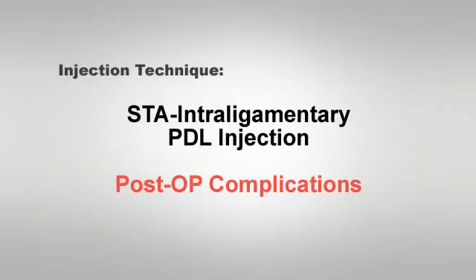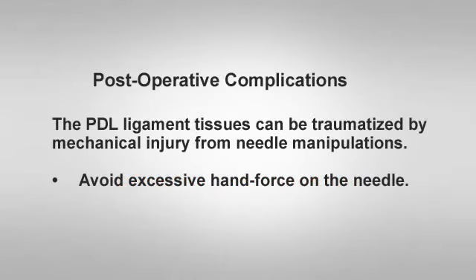Post-op complications. There are 3 primary reasons for post-operative discomfort from the PDL injection. These are, first, the PDL ligament tissues can be traumatized by mechanical injury from needle manipulations. It is important not to use excessive hand force when placing the needles into the PDL space. Wedging or forcing the needle into the PDL space can cause post-operative discomfort.